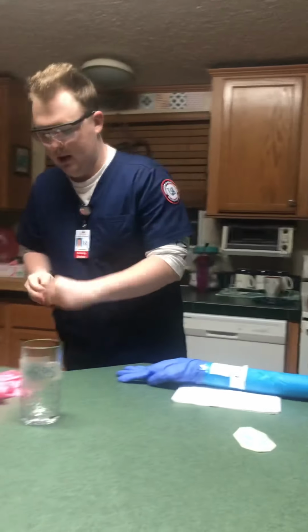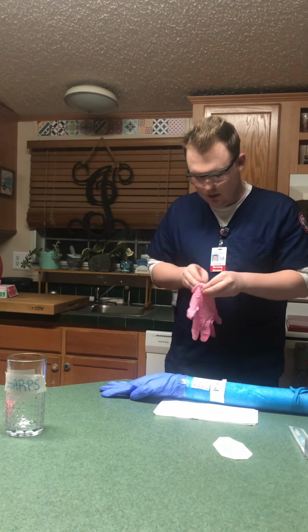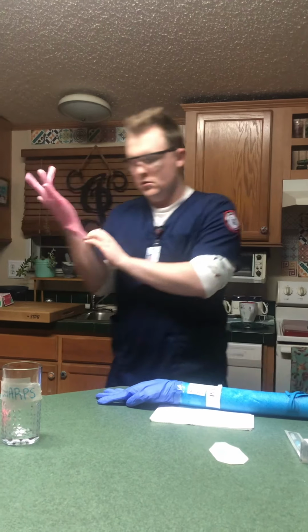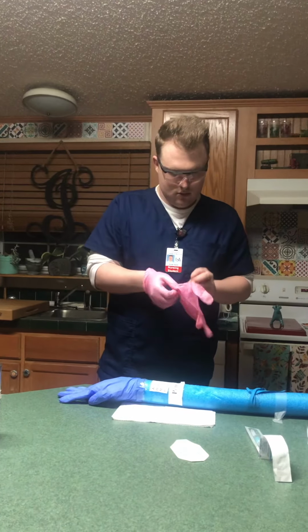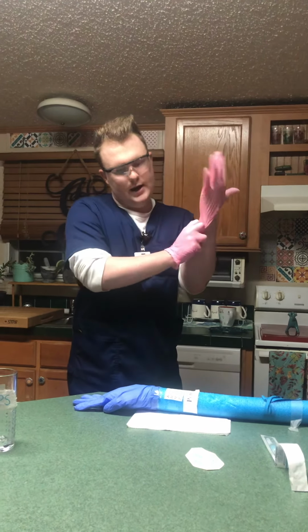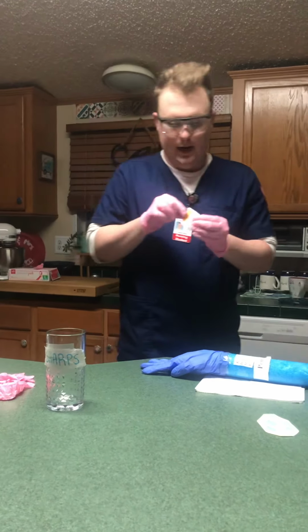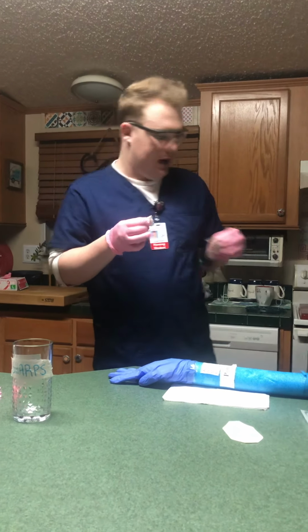So now I'll perform hand hygiene and don my clean gloves. Okay, now that I've donned my clean gloves, what I would do is clean the site with a chlorhexidine prep, but one didn't come in my blue bag or my IV starter kit, so I'm just going to use alcohol, but normally I would use a chlorhexidine prep.